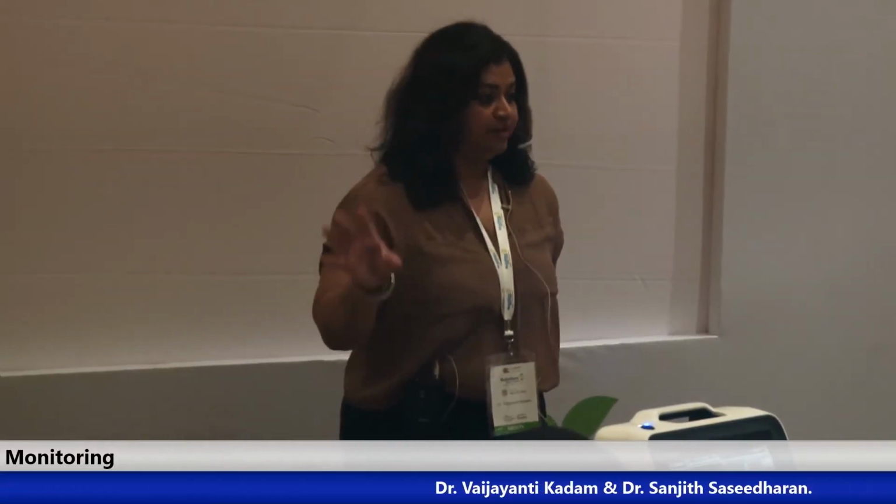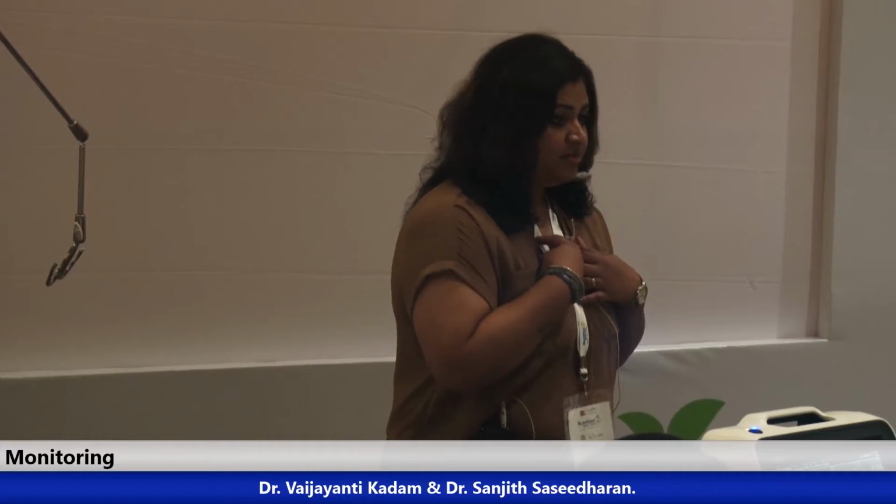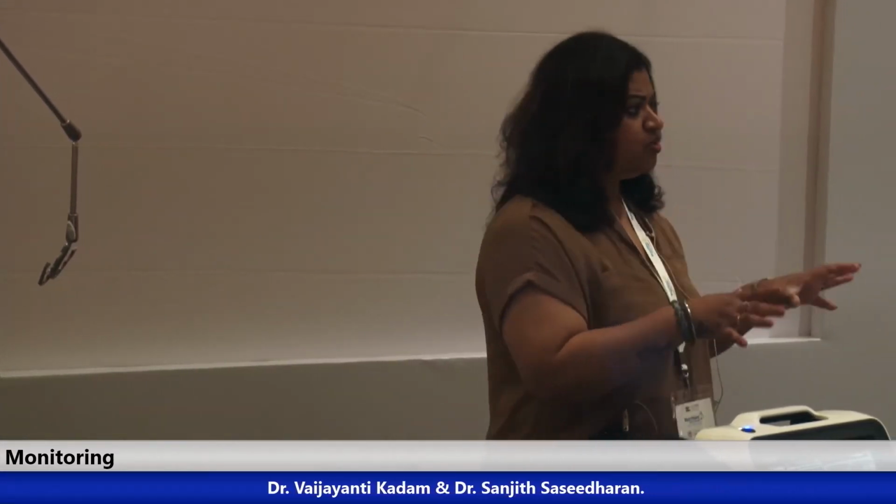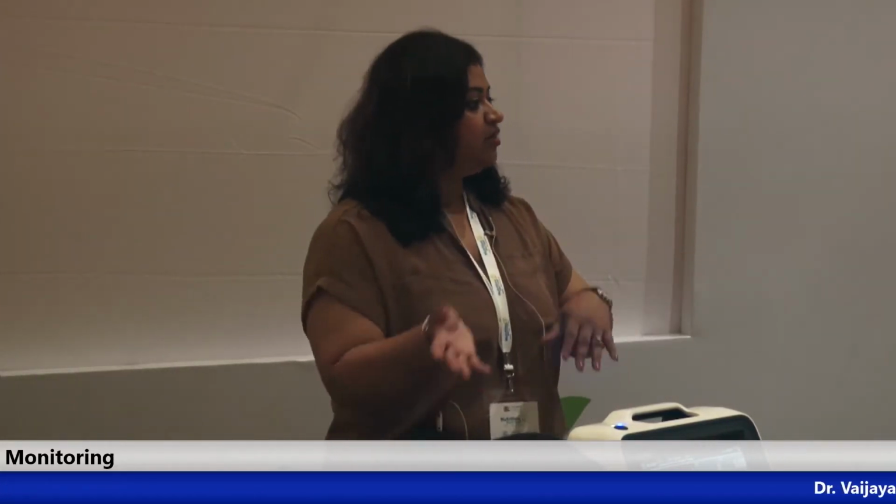So what are these methods? These methods are near accurate measurements because they measure the caloric requirement, they do not predict it. Doesn't this sound attractive? Because we are going to give that patient what he requires at that particular time. So if a patient is severely in myxedema coma, their metabolism is extremely low, and we blast them with 2500 calories, what is going to happen to our patient? They are probably going to worsen, and probably the next day they're going to go on a ventilator.